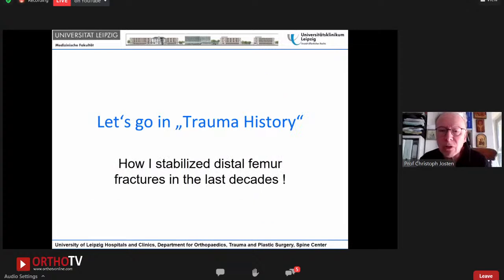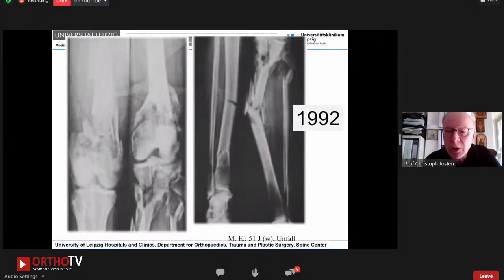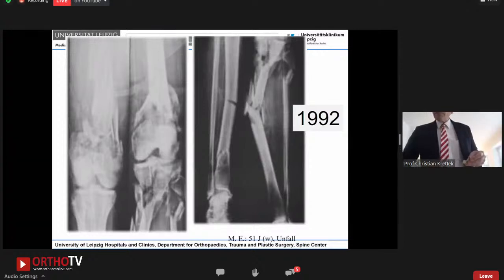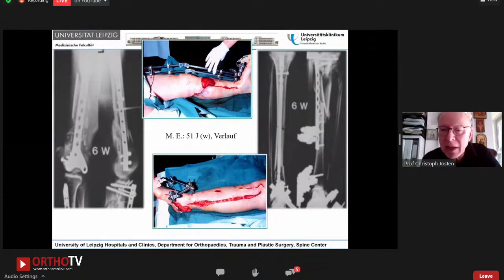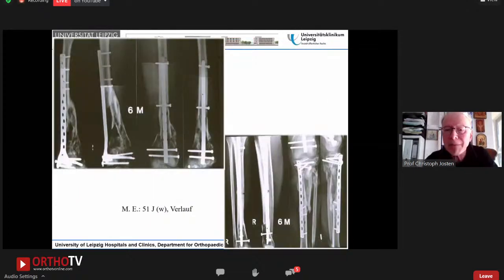Let's go into a trauma history. How I stabilized the distal femur fractures in the last decades. This is a picture of a patient I treated almost 30 years ago. It's a real complex trauma, bilateral, with severe fracture. But this was in 1992. And we made a very simple fixation with implants we had at this time, not angle stable plates, not sophisticated intramedullary nailing systems. You see this picture after 6 weeks, a pure bridge plate, the first retrograde nail, an antegrade nail, unreamed antegrade nail, and a simple plate on the left proximal tibia. So implants we would not use today. But this is a picture 6 months later, an uneventful procedure in a 51-year-old lady.